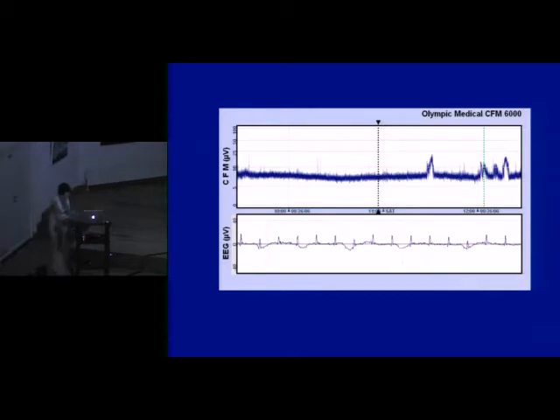But what about this baby? This was a really, very, very asphyxiated baby. And who would assess this EEG? Who dares? Actually, it's a bit odd. I mean, the bandwidth is too narrow. The baby is encephalopathic clinically.